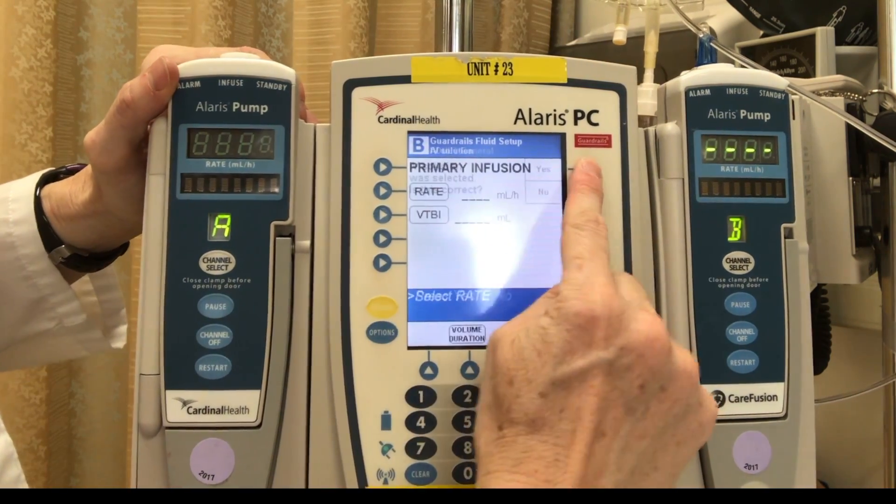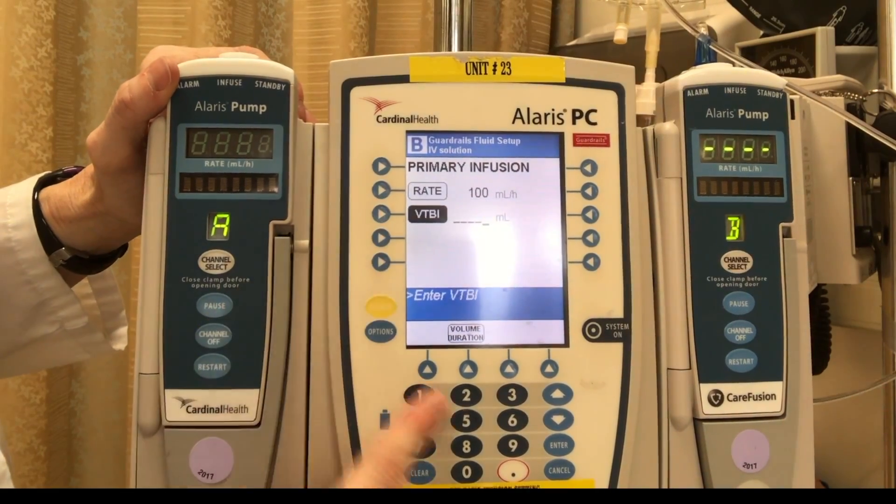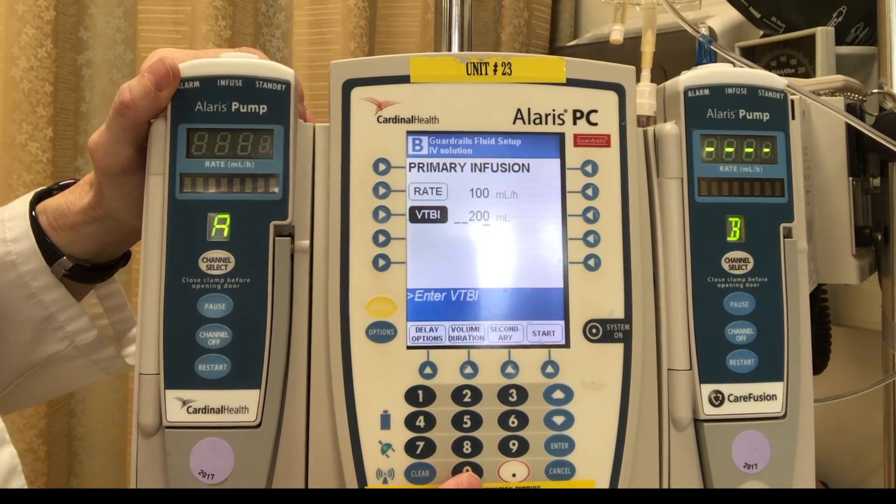I want guardrail IV fluids, and if you're not sure you can always press and look for those. I'm going to select IV solution — yes, that is correct. My orders were for a hundred, and I have a 250 mil bag hanging. I always like to give myself time, so I'm going to take off 50.